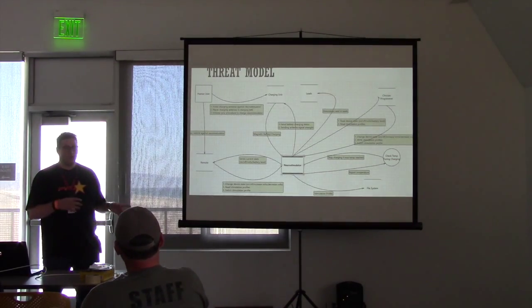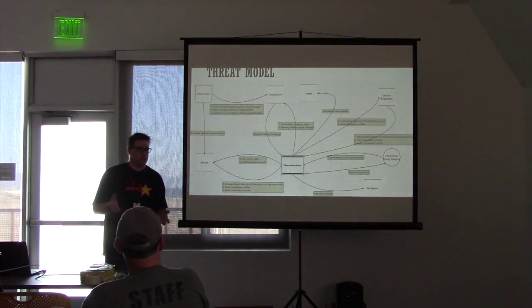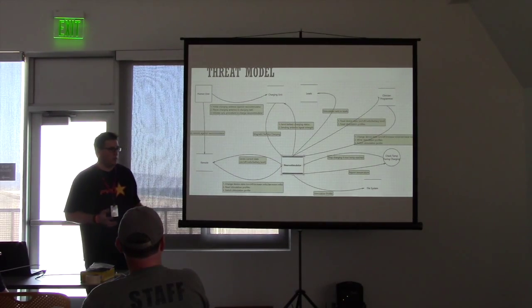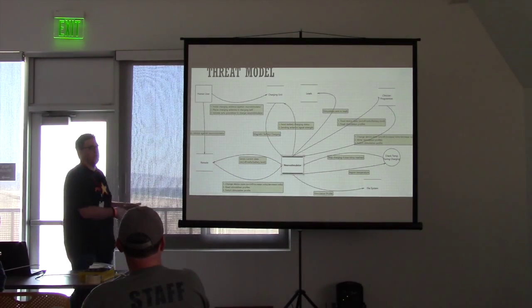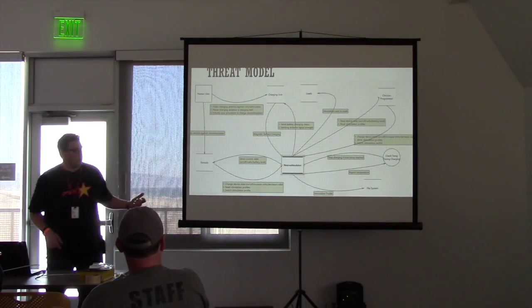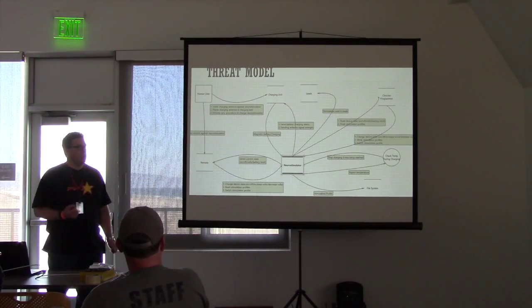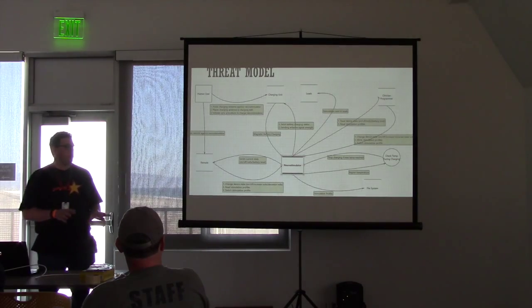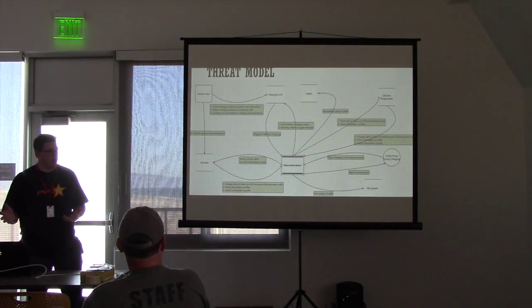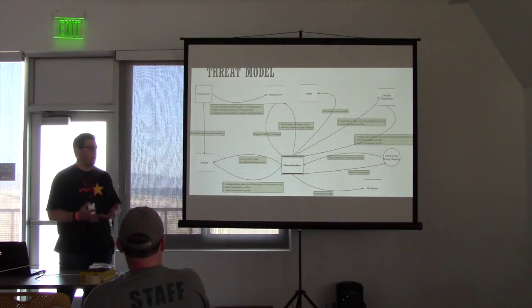But luckily, and this is where we get to usability versus security, they were able to send us a remote, which is normally $150. It took a week and a half to get the remote. For that time, luckily we had gone swimming and she didn't have the stimulation device on, so she wasn't able to use it. But at that point, all she had to do was touch that remote to her body and it immediately worked. So there's a security risk in there, but there's also a usability issue, because had she gone to have it reprogrammed, that's a lot more time that she doesn't have that kind of pain relief.